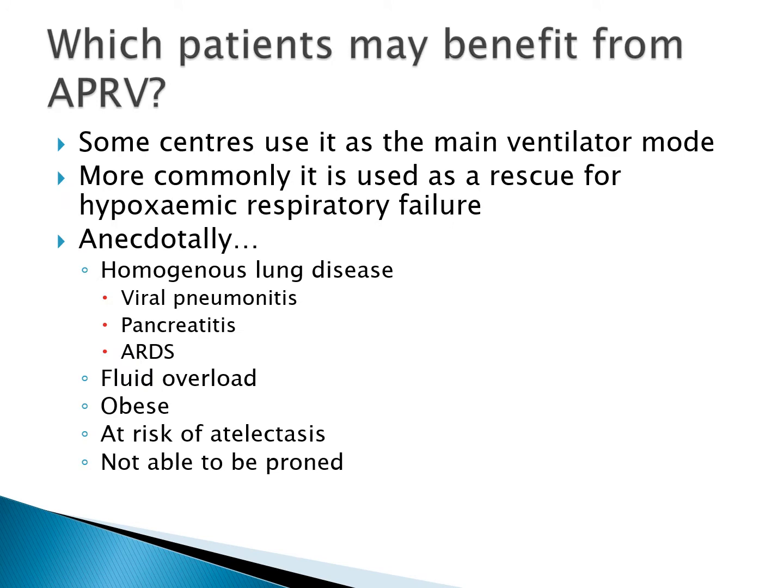So, which patients may benefit from using airway pressure release ventilation? Well, it's true to say that some centres do use it as their main mode of ventilation for patients, but more commonly, and certainly where I work, it's used as a rescue for patients with severe hypoxemic respiratory failure.